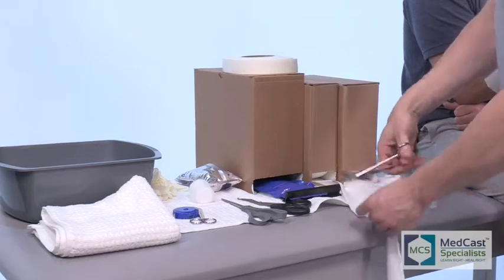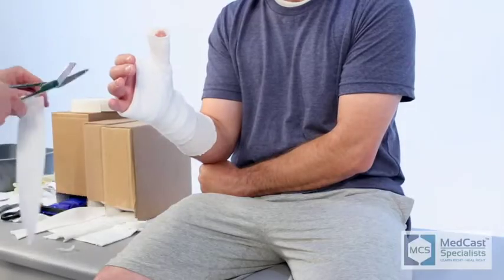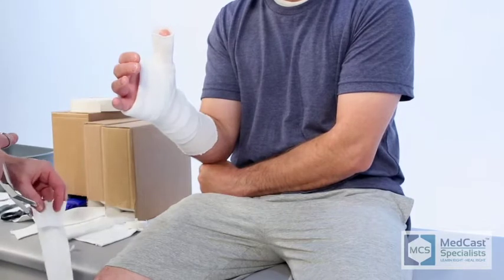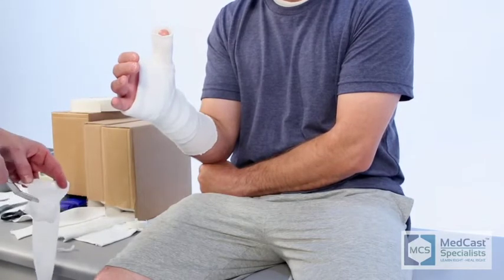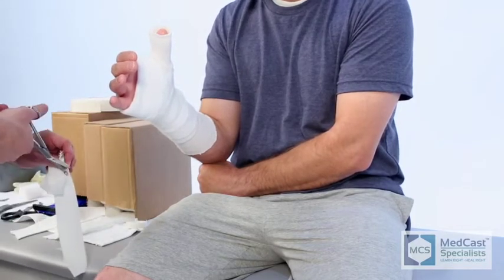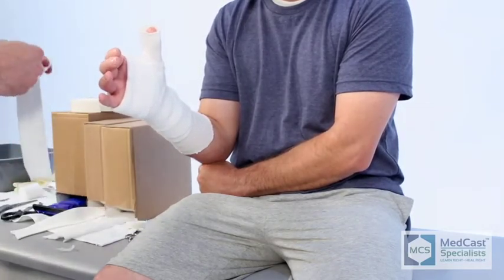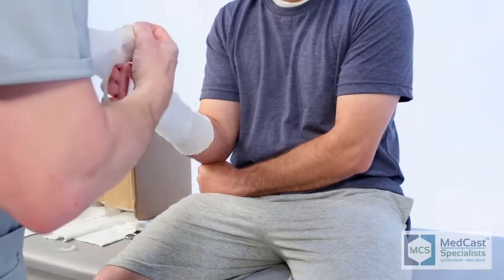So you can watch the technique here of the application of the third strip of stockinette that we put on here, because we also put one on the thumb. If you cut it like we did there on the sides, it kind of gives you wings. So as you pull it through the digits, it gives you something that you can anchor the stockinette to, so it doesn't end up pulling back up.